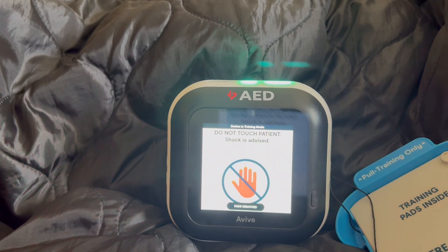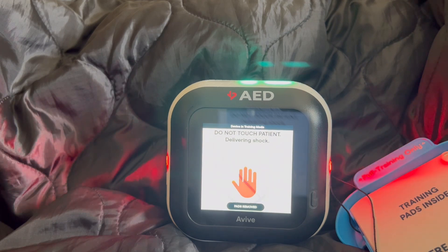Shock is advised. Move away from the patient now. Stand back, delivering shock in 3, 2, 1. Shock delivered.